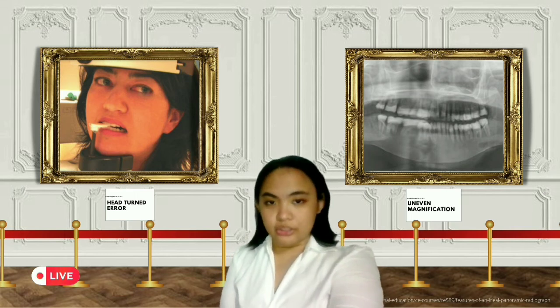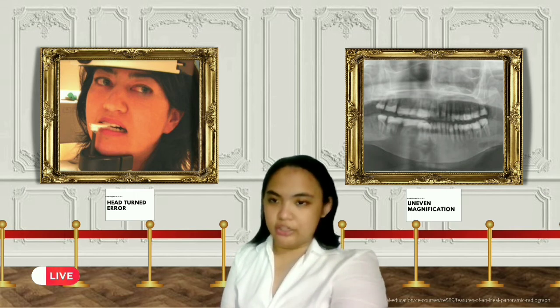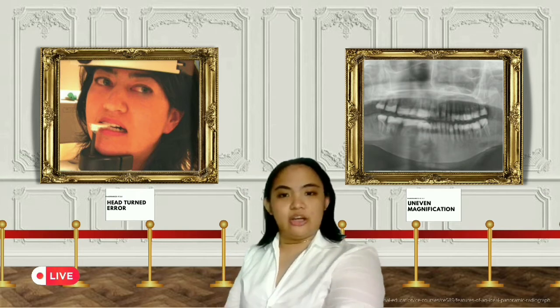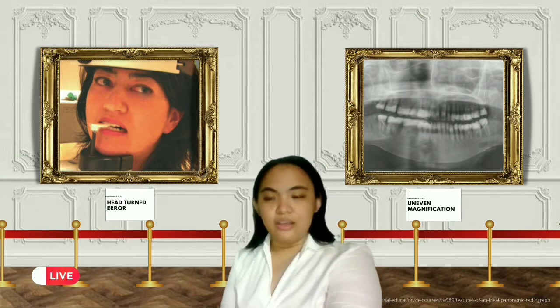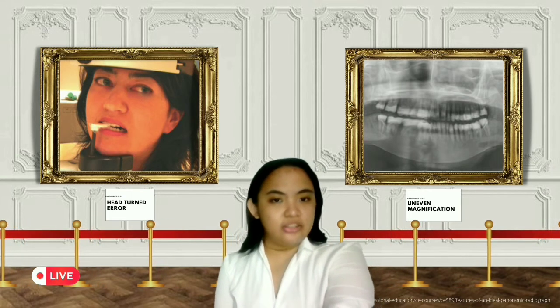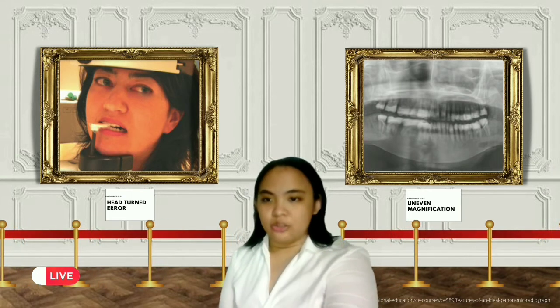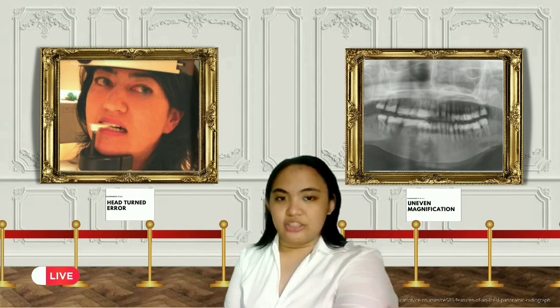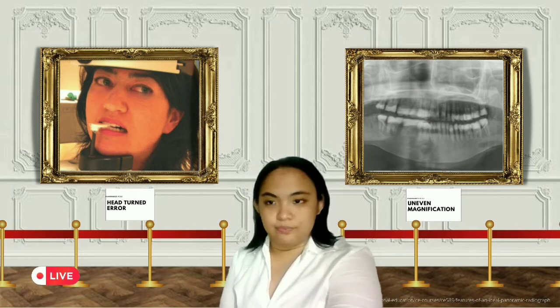The side furthest from the receptor appears magnified and the side closest to the receptor appears smaller, as seen in today's radiographic image. For example, if the patient's head is turned to the right, the teeth on the patient's right side are closest to the receptor. The teeth closest to the receptor demonstrate the least amount of magnification.